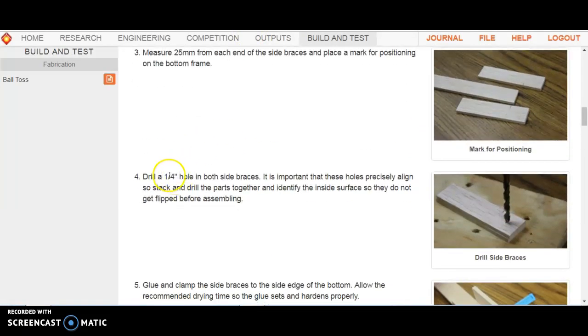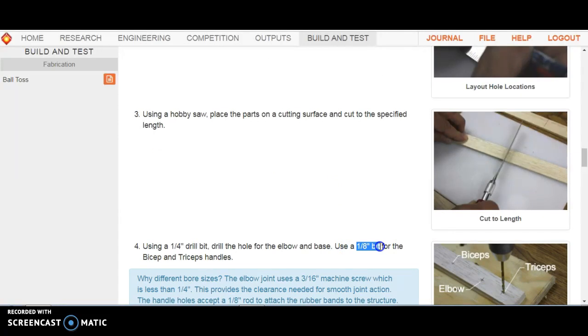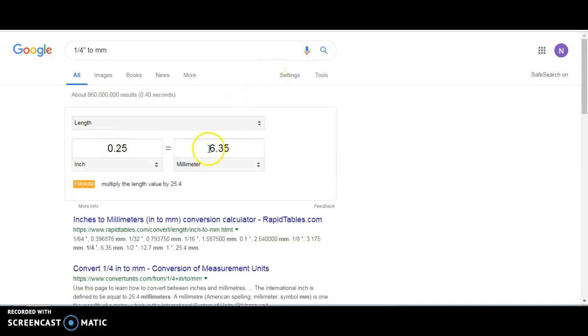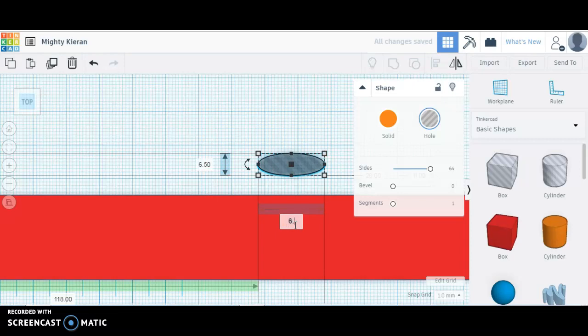So here I'm told that the larger hole is 1/4 inch, and further down I find that the smaller holes are 1/8 of an inch. So I could just convert to millimeters and set this at exactly 1/4 inch. Converting 1/4 inch to millimeters, I find that that's 6.35 millimeters. However, we learned that when we 3D print these holes, because we're dealing with melting plastic, they nearly always print smaller than designed. So we want to design this a little bit larger. I'm going to design these holes for simplicity and just based on past experience at 6.5 millimeters to obtain the equivalent of a 1/4 inch drilled hole.